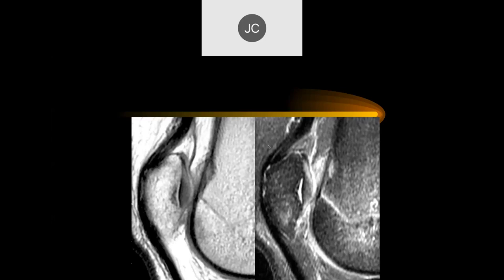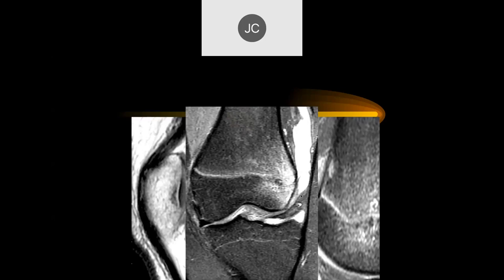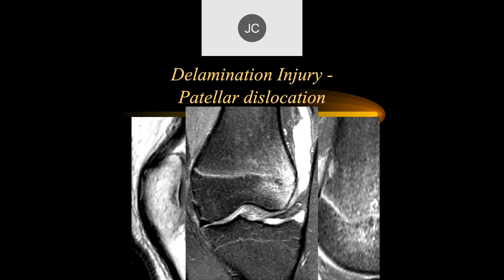Looking at the patellar cartilage on the PD fat sat image, it looks like there's separation of the cartilage from the bone — like a delamination, maybe. There's edema in the lateral femoral condyle, maybe from a patellar dislocation. This is a transient patellar dislocation. It's relatively common to get injuries to articular cartilage with patellar dislocations — these glancing blows tend to produce delamination type injuries.